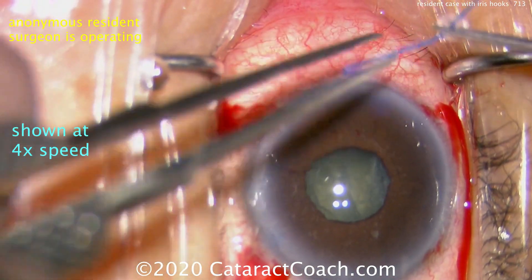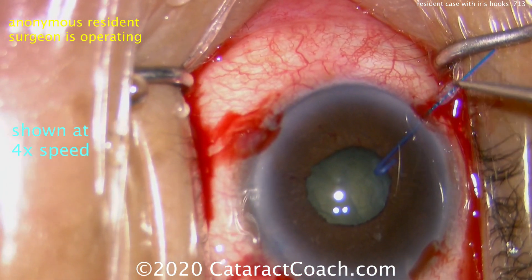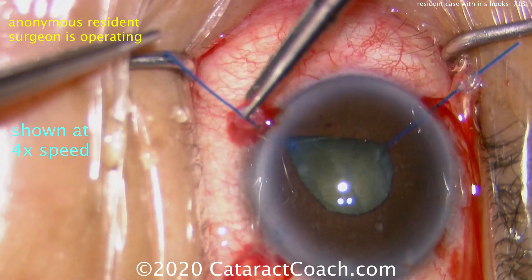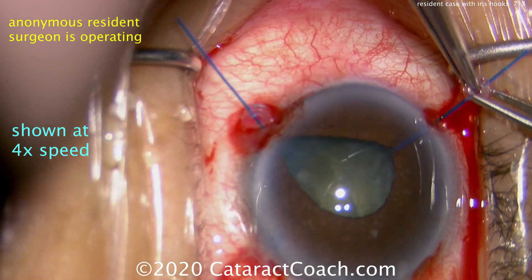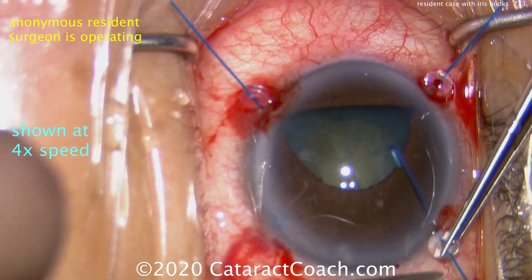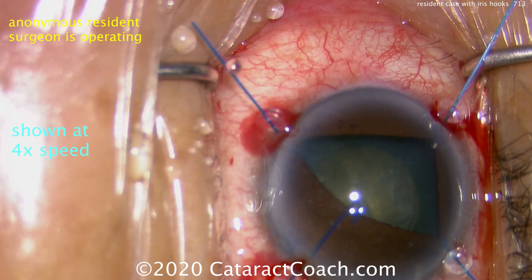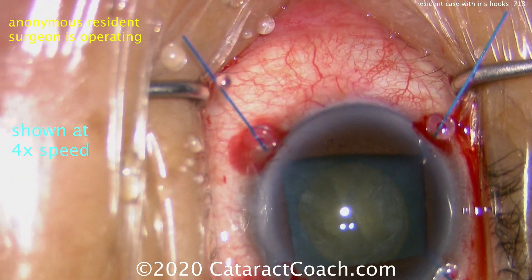Here are the four iris hooks being placed in a square pattern. Some surgeons advocate placing all five hooks in a pentagon pattern, or some use just four in a diamond pattern, with one hook directly beneath the phaco incision. Any of these arrangements is acceptable. The technique is: once the hook is in the eye, get it around the edge of the iris at the pupil margin, pull the hook, and pull the stay collar right down to the limbus. Once you have all four in, you can adjust their position and tension to make it a little bit tighter and larger. Now you can see the capsulorhexis, which was done very nicely — a beautiful rhexis.